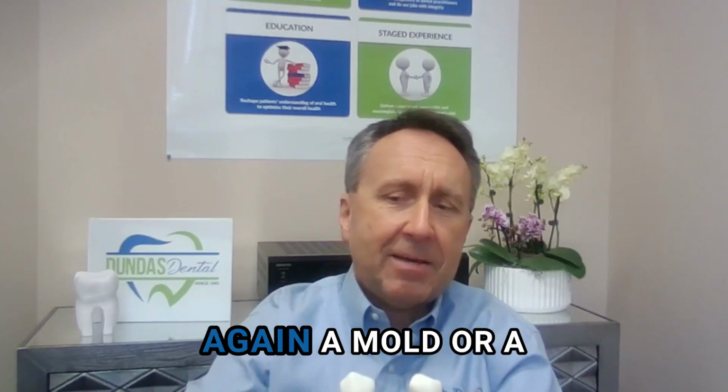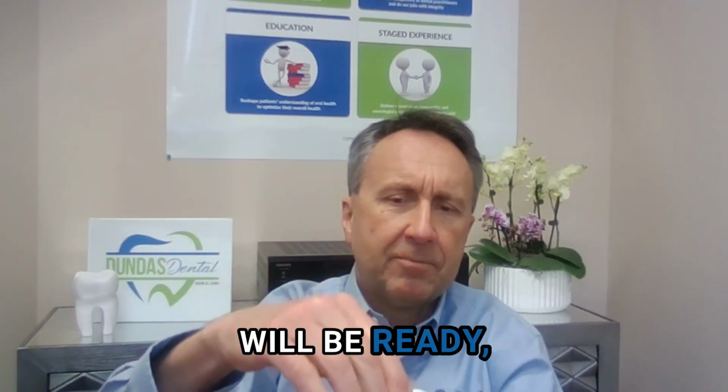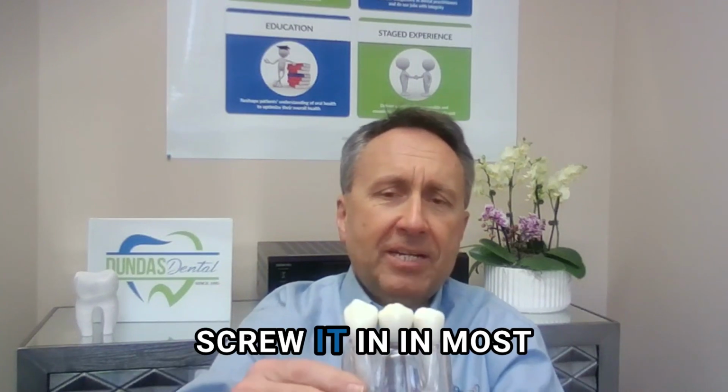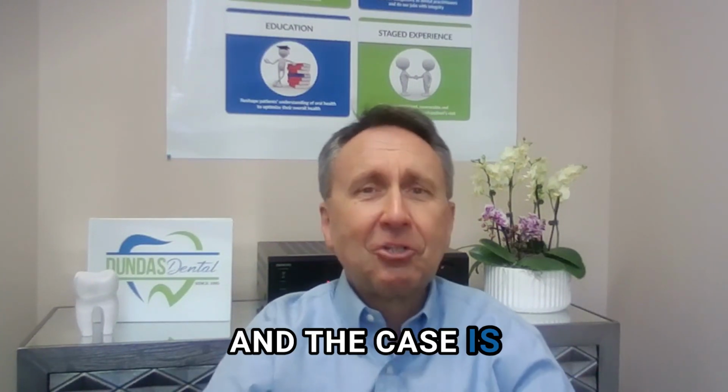And then we will take, again, a mold or a scan. And about a week later, the crown will be ready. And we will either screw it in most cases or sometimes glue it to the implant. And the case is closed.